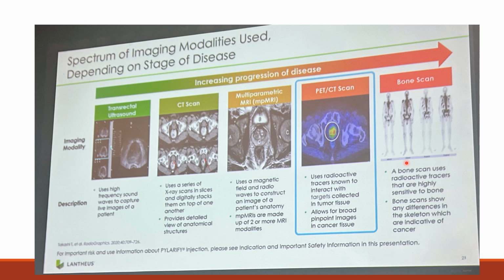Initially, they can get FDG and PSMA as a baseline when they first get diagnosed. That will help determine their treatment. Fluciclovine is used if their PSA numbers start to rise in their bloodstream, and we suspect that the cancer may have returned. So after they initially diagnose them, they get the FDG and the PSMA. They'll probably get a bone scan at that point too, just to look baseline and see where they're at, determine their treatment plan. Let's say they had no bone mets, they got castrated, and now they're doing good.